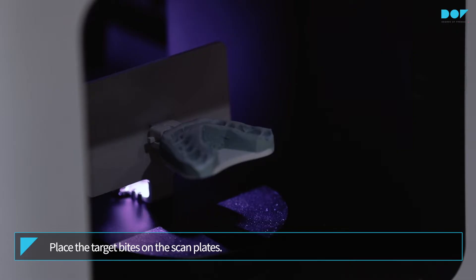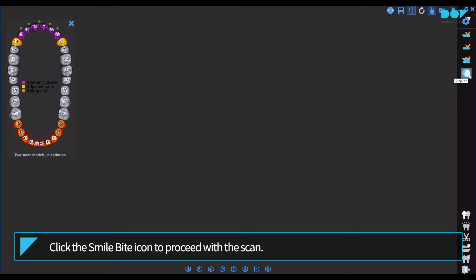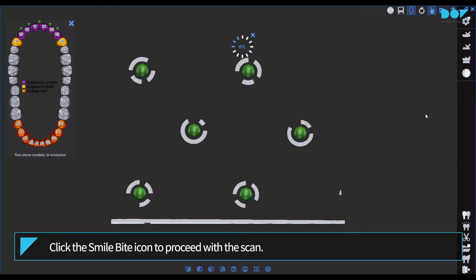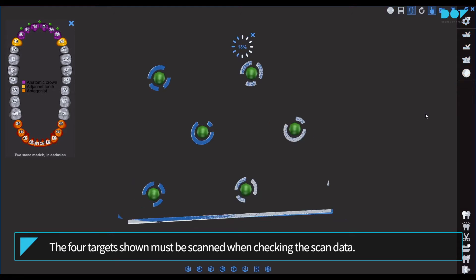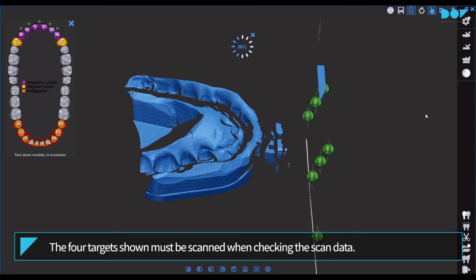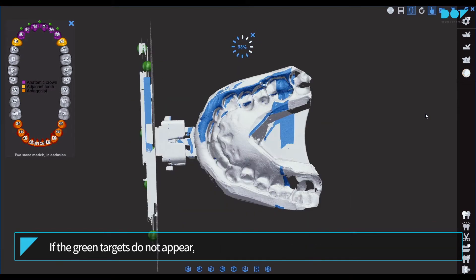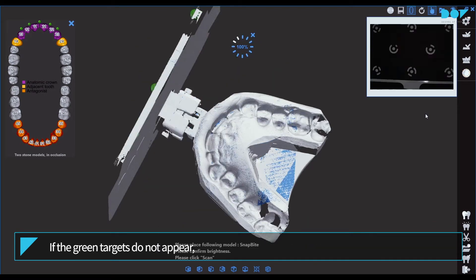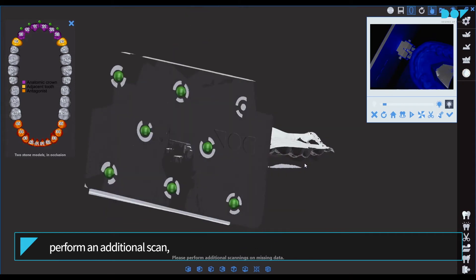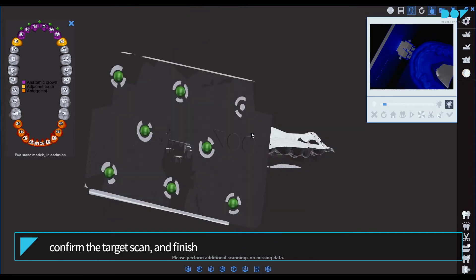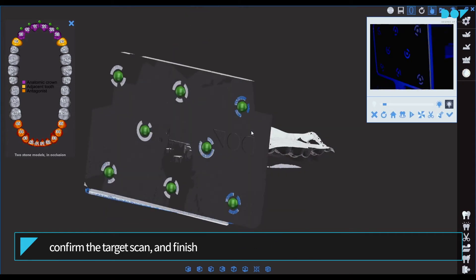Place the target bites on the scan plates. Click the smile bite icon to proceed with the scan. The four targets shown must be scanned when checking the scan data. If the green targets do not appear, perform an additional scan, confirm the target scan, and finish it.